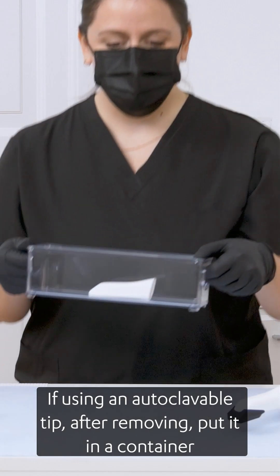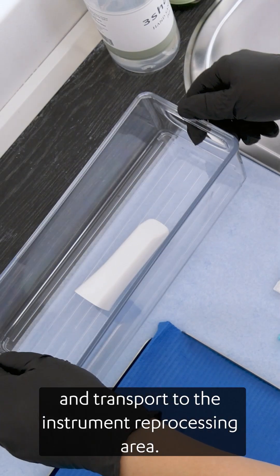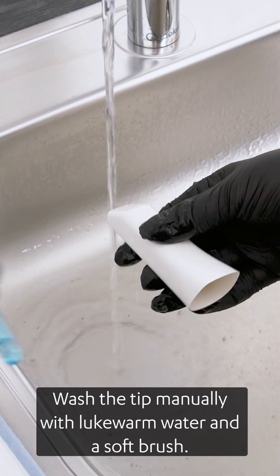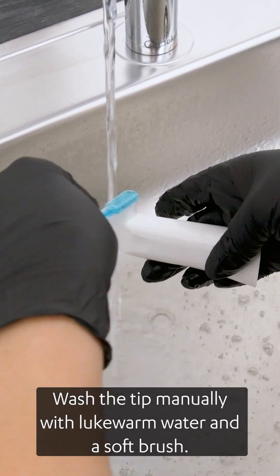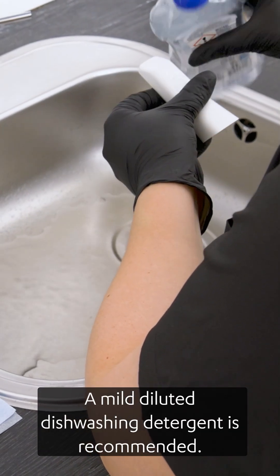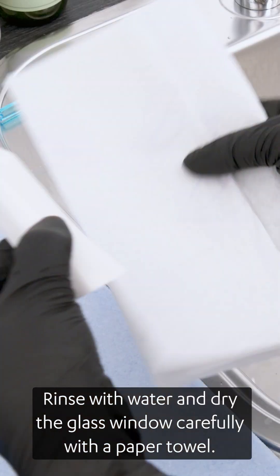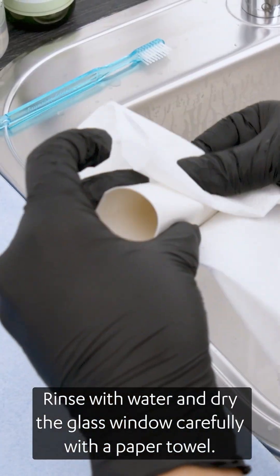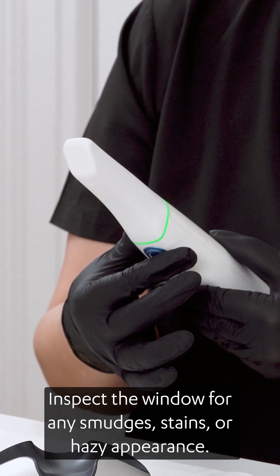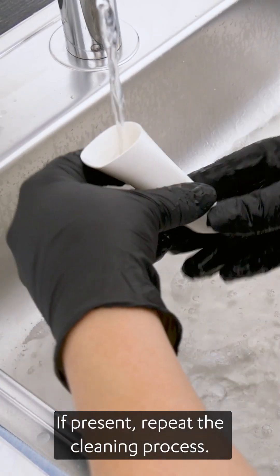If using an autoclavable tip, after removing, put it in a container and transport to the instrument reprocessing area. Wash the tip manually with lukewarm water and a soft brush. A mild diluted dishwashing detergent is recommended. Rinse with water and dry the glass window carefully with a paper towel. Inspect the window for any smudges, stains, or hazy appearance. If present, repeat the cleaning process.